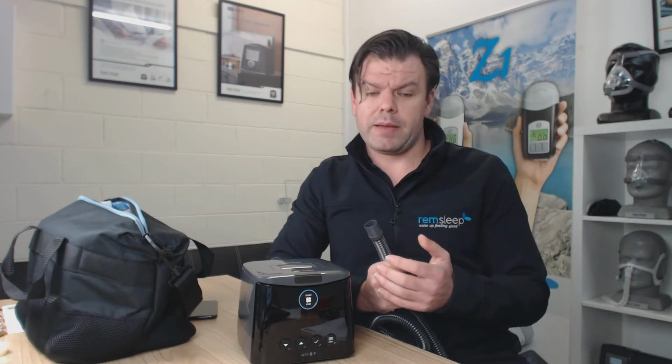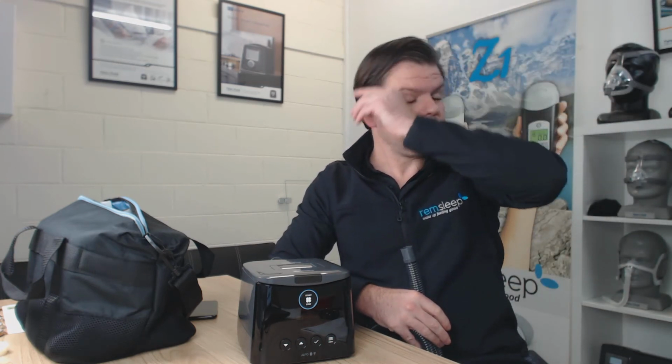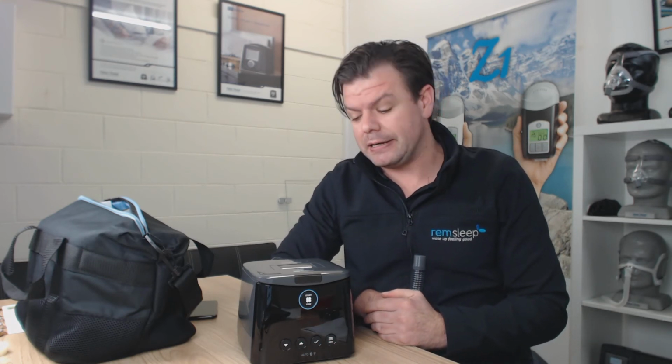The modem enables the data to be wirelessly sent to your healthcare provider so that they can keep track of you as well. So you don't have to constantly be going in for visits and things like that. The data can sync directly with the web, the cloud system. They call it InfoSmart. So the technology is now getting pretty advanced, and that's really good.